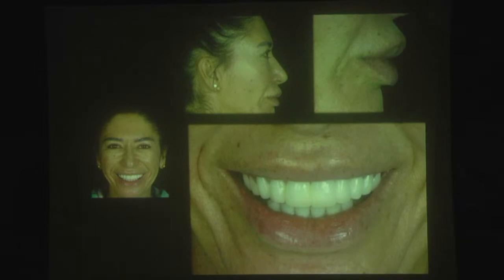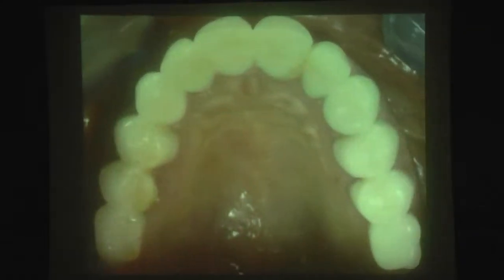So it is very important to see everything, to feel what the patient is looking for, and the attitudes. So we have to be very careful about the attitudes to the doctors. So you see the crack, and she bumped her head on the glass, and this was a zirconia bridge, and zirconia crowns have a very big disadvantage of chipping and cracking.